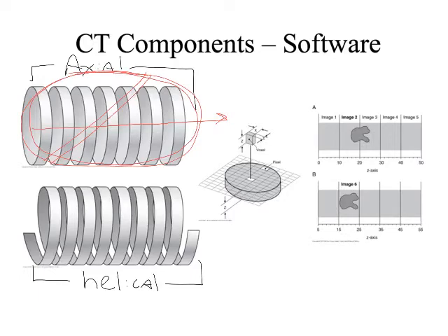But it is able to interpolate really accurately. So think about it like this. I've got that slinky again. In this case, what I'm doing is moving the table and scanning the patient at the same time. None of that move the table, scan the patient, move the table. I'm just move and scan. Get them through. And so I get this slinky-like spiral of information, right? But when I compress that down in my computer, now I've got a solid chunk of the patient's body, and I have spatial information and attenuation profiles for that solid chunk.